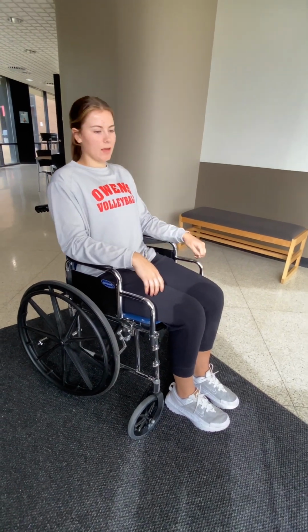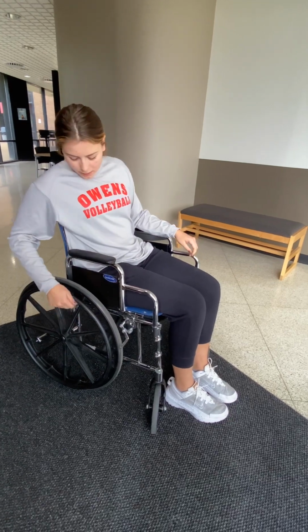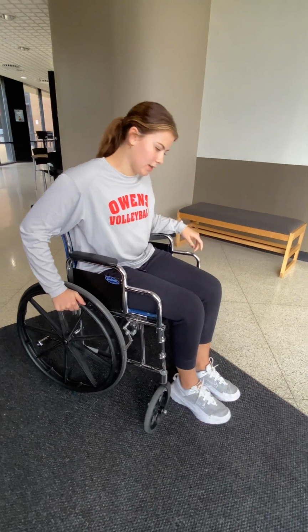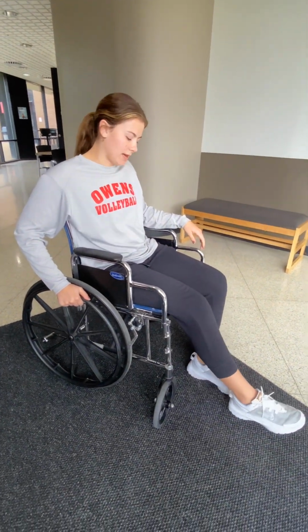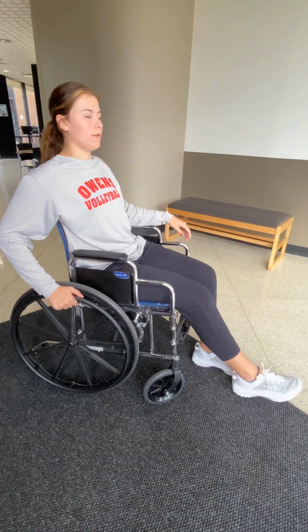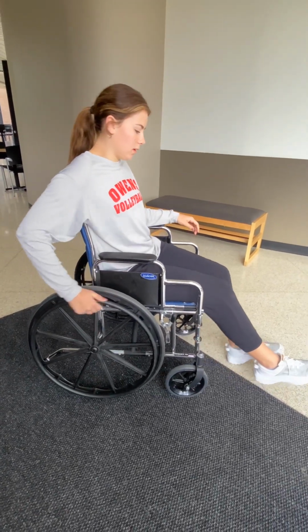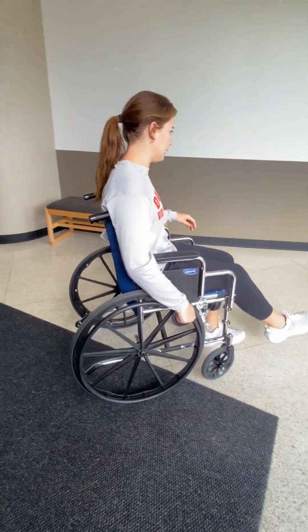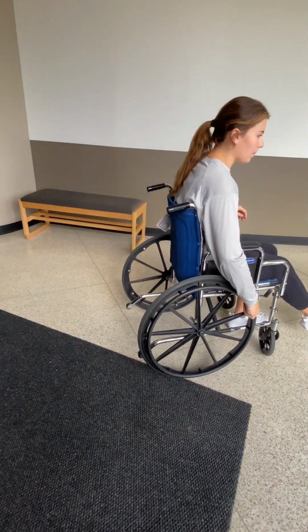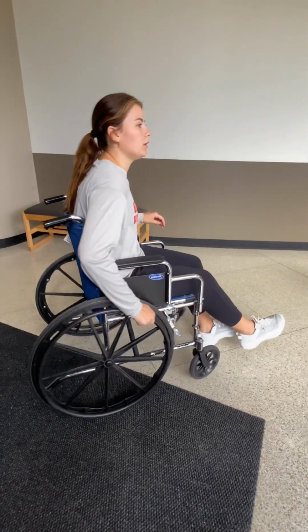So if the patient has a functional right arm, they'd use their right hand on the rim, and whatever leg is functioning, say it's the left leg, they would use that leg to first go forward by using the heel and the foot to push forward, and this hand to go clockwise. To go backward, you would do the opposite: go counterclockwise on the wheel and use your heel to push.